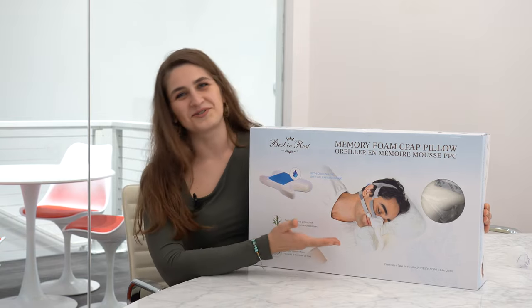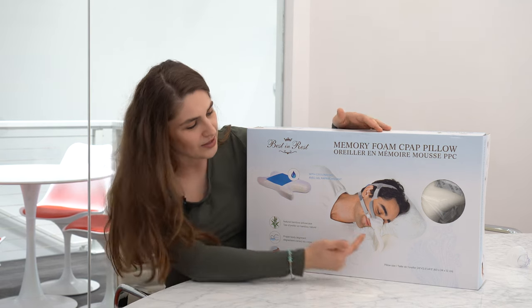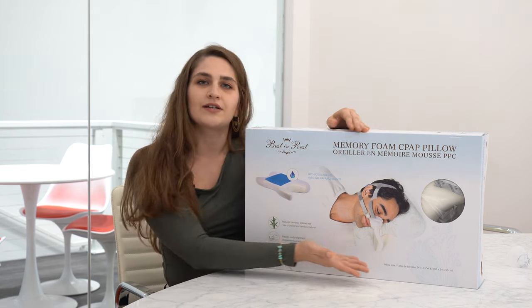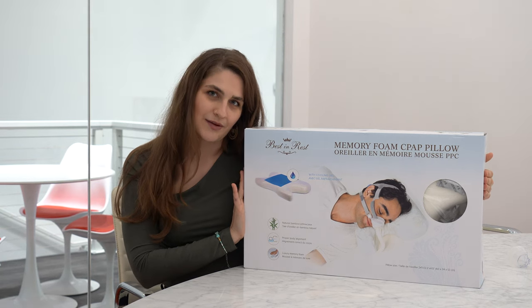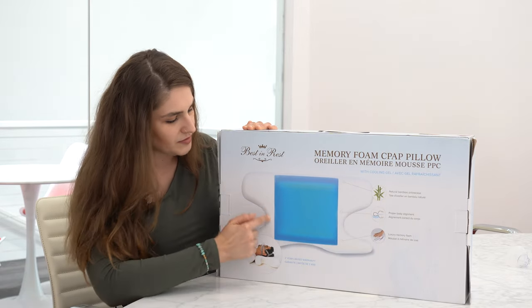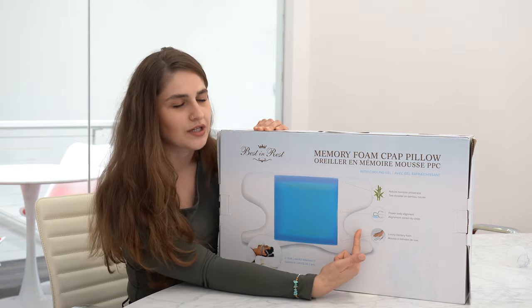Here's an example of someone demonstrating how a CPAP pillow works — he's laying on his side where his mask would have obviously been hitting his pillow and breaking the seal, but here he is resting comfortably. When you're looking at this pillow, you can see there are two cutouts on the sides. Your head would be here, and when you turn onto your side, your mask would not be hitting your pillow because it's completely cut out.